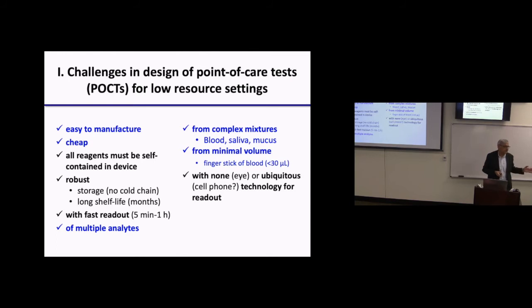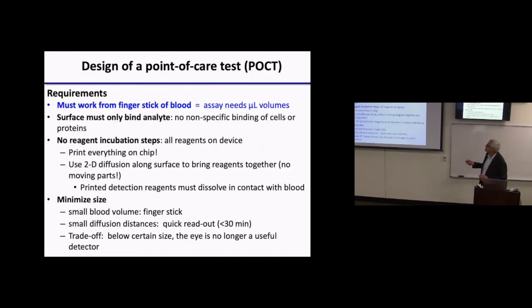And it will keep dropping, because this is electronics and everything keeps dropping. It's not as if every patient is going to have their own smartphone or smartphone-based detector in Africa or India, so the doctor or the clinic will have it. If my cost is on the order of a few $100, it's possible for tertiary care clinics and those roadside clinics to own one of those devices. In fact, you could probably give it away.